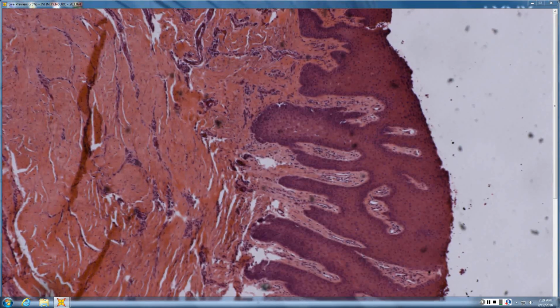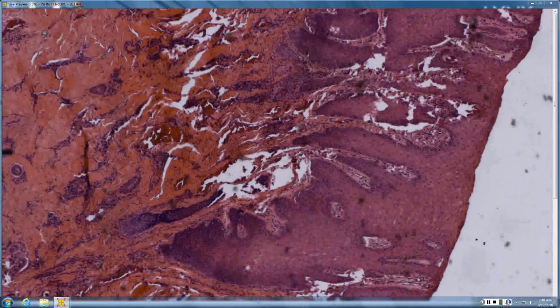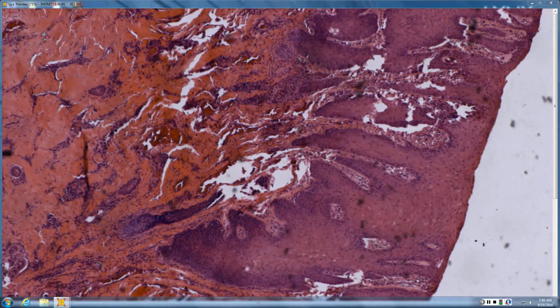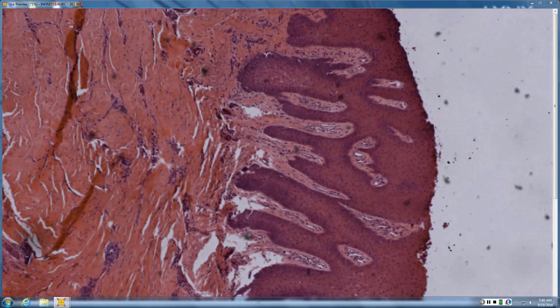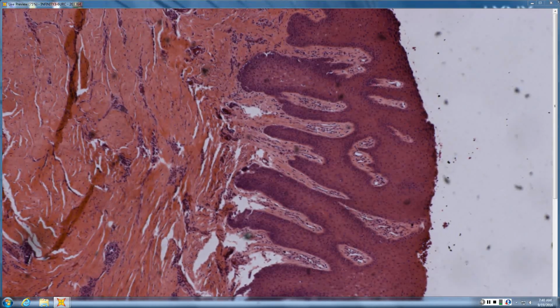All right. So some slender acanthosis. And I'd say some are slender, some are fat. They certainly vary, right? So is the intervening epidermis fat, or is the intervening epidermis skinny, and all the thickening relates to adnexal structures? Yeah, I agree with that statement. So probably the second one, which is what's characteristic of pseudoepitheliomatous hyperplasia. In PEH, the surface epidermis really doesn't take part in it much. It's all the adnexal epithelium that thickens.